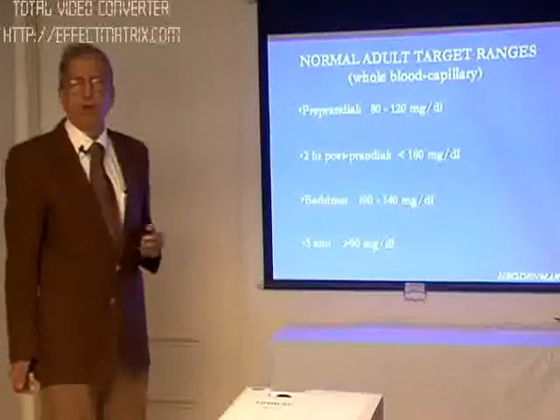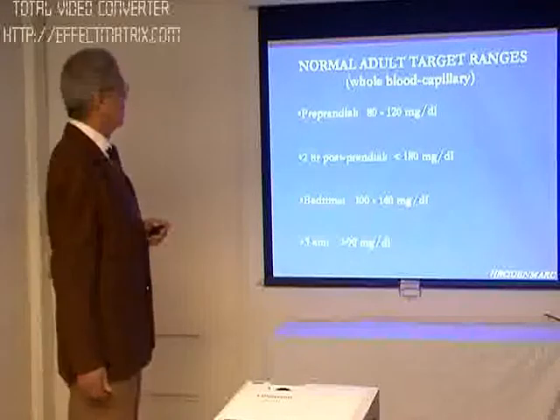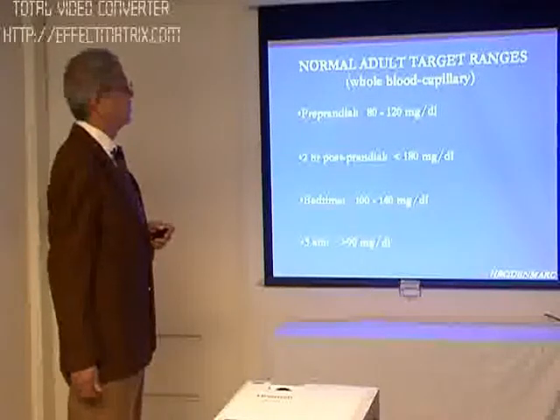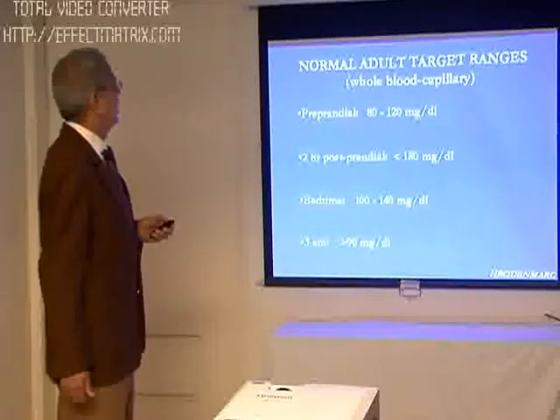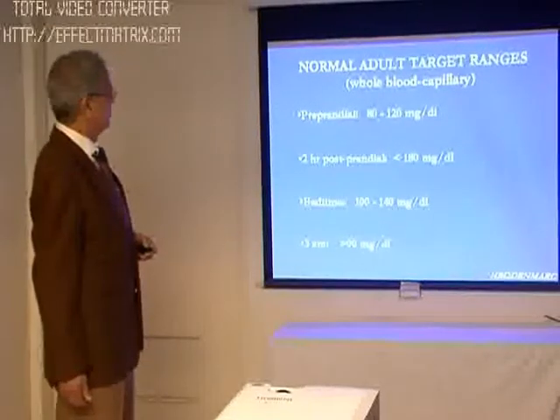And there, of course, we will also describe the features of commonly available pumps in the country, which of course belong to mainly two companies, the Roche and Medtronic. Now the targets we have already discussed. Next slide.